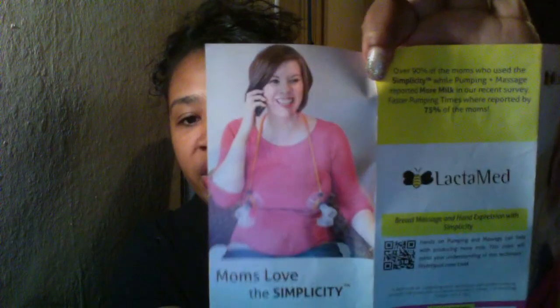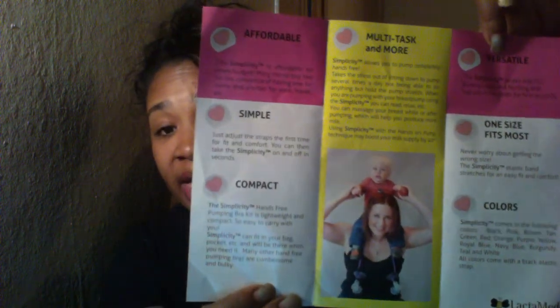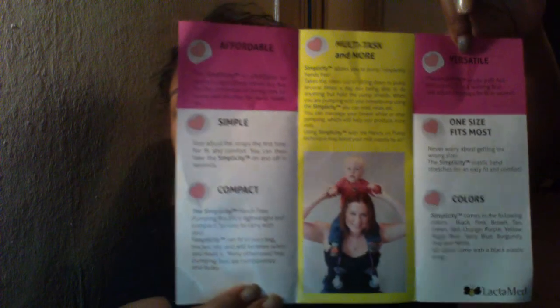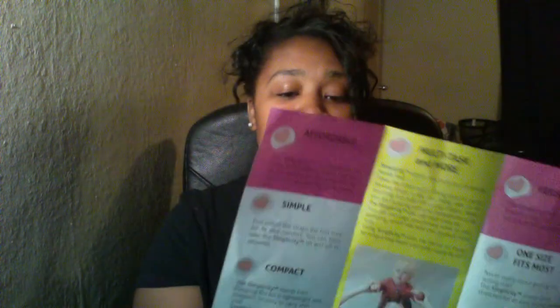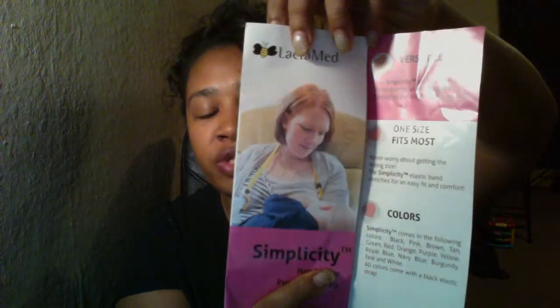As you can see, she's wearing it right here. I'll show you the pamphlets. One size fits most, and it's compact. They come in different colors, simple to use, versatile. Here's someone showing how you can still nurse and use it at the same time. They sent me a pink one here, which is their older model.